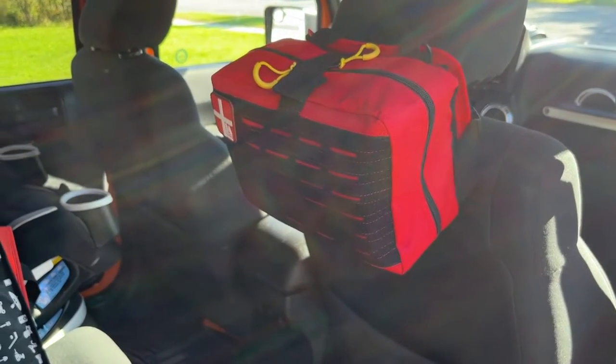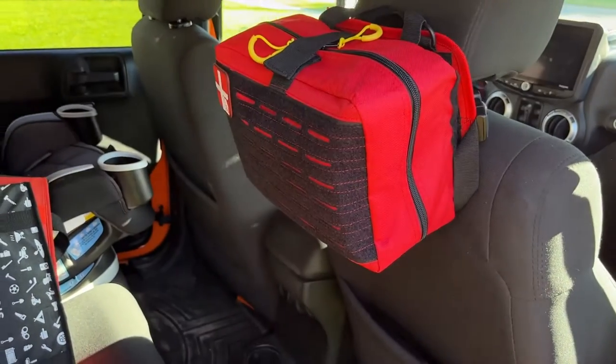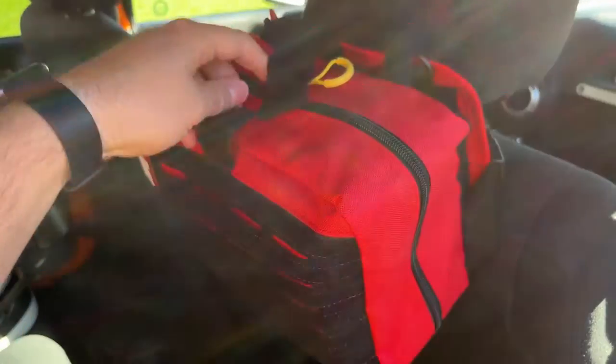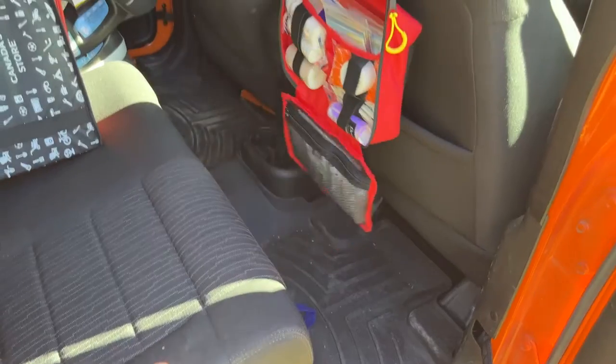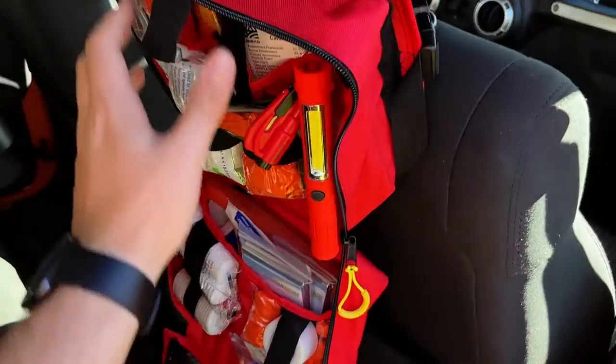This is a quick look at our vehicle trauma response first aid kit in the Jeep. You can use this kit as it's attached in the car, so if you just needed to grab something from it, you just undo the velcro, undo your zippers, and the whole kit folds out. Everything's well secured so you're not going to lose anything — you can just grab the item you need.